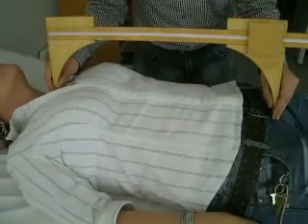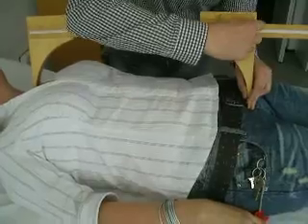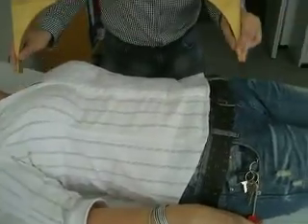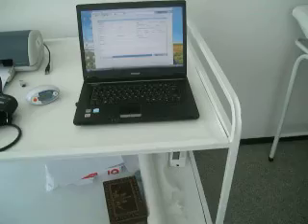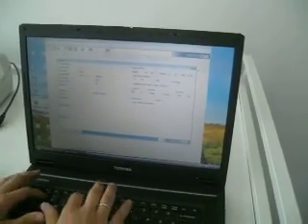So now, if I make the measurement, it will give me a reading here, around 51 centimeters. So that is a good estimation of the true aortic length. So that's how we get the distance from which we can calculate pulse-wave velocity.